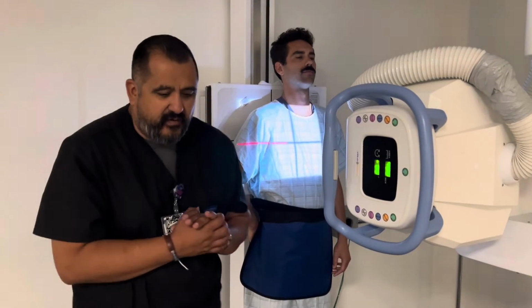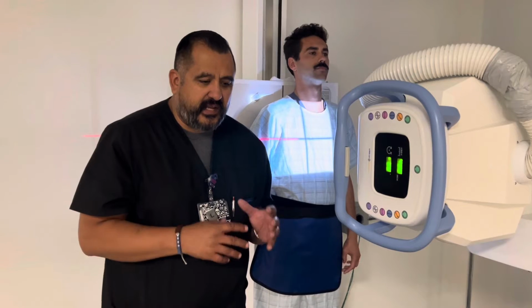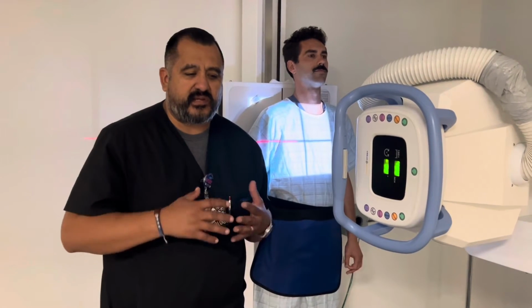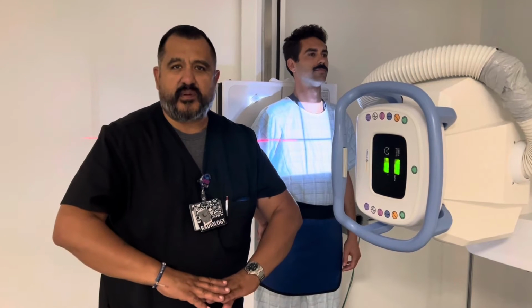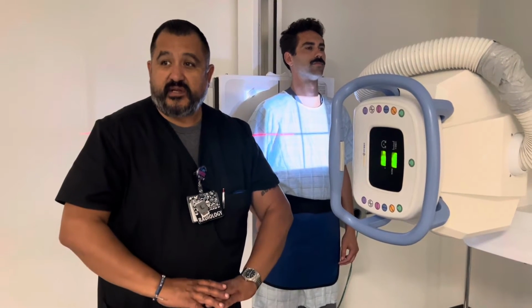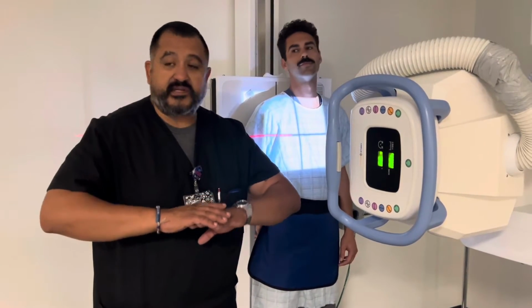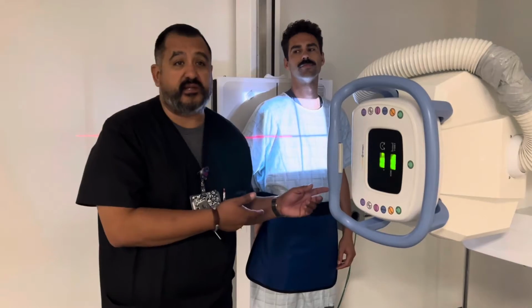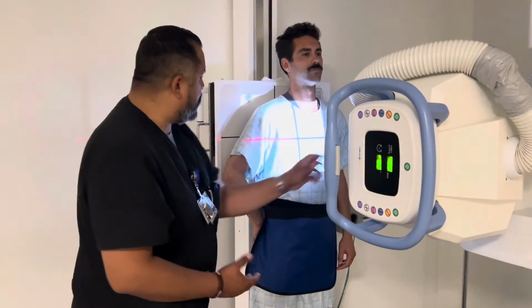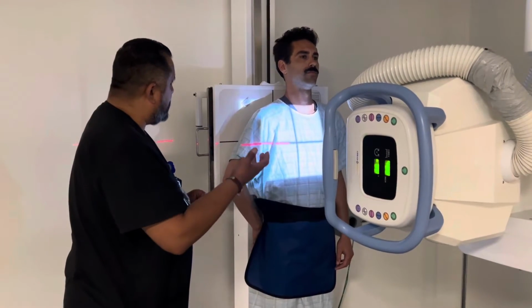So if you want the diaphragm to move down to its lowest position, how do we get him to breathe? What do we have to do to get him to breathe so that the diaphragm comes down? Do you guys remember? Do we do it on expiration or do we do it on inspiration? It's going to be on inspiration. So you want the diaphragm to go down, and that's why we're doing it erect, because gravity is going to pull that diaphragm down further. So we're going to have you breathe in, sir, let it out, breathe in again, and hold it.